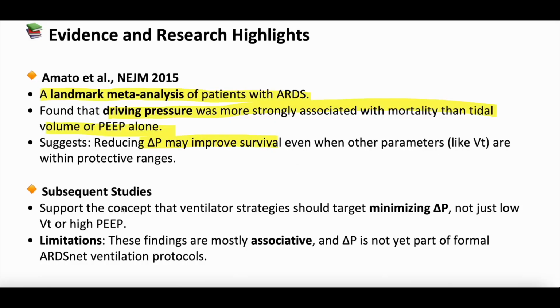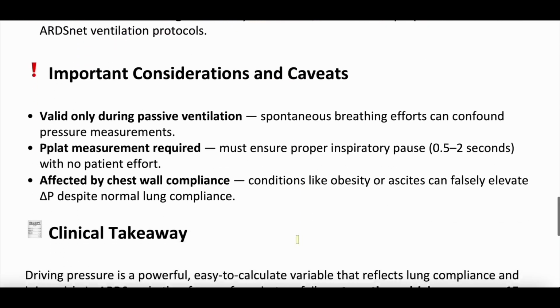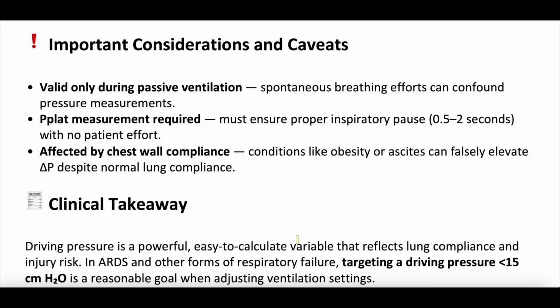There have been subsequent studies that kind of support this concept that you should be targeting a lower driving pressure, not just tidal volume or PEEP. But most of these are associative studies. There hasn't been, at least as far as we're aware, these robust RCTs, although they probably will be coming, so stay tuned. When we think about important clinical considerations and caveats, again, this is really only valid during passive ventilation.